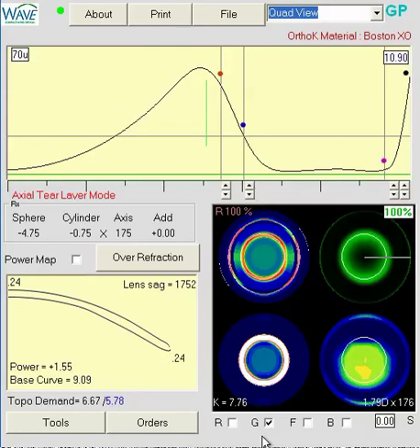I think GSIM is fine, smaller OZ and IC, and then align the horizontal meridian to get as much touch across the periphery of the lens as possible. In the left eye, again, I think the base curve will be pretty close to 9 or 9.1.